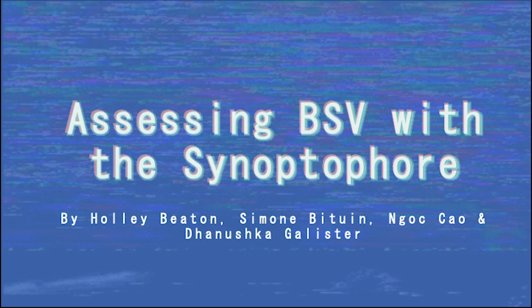Hi, you are watching the video on how to use the synoptophore. We'll talk about what it is, how we set up a patient on the machine, how we test binocular single vision, interpreting the results, and the test pros and cons.